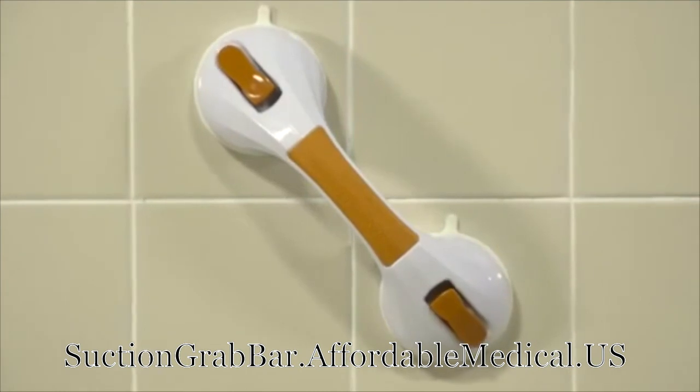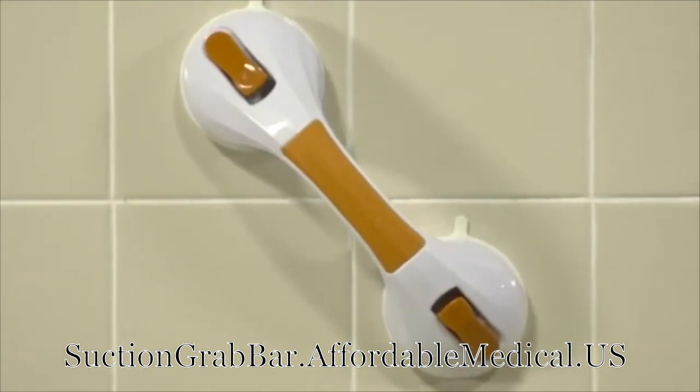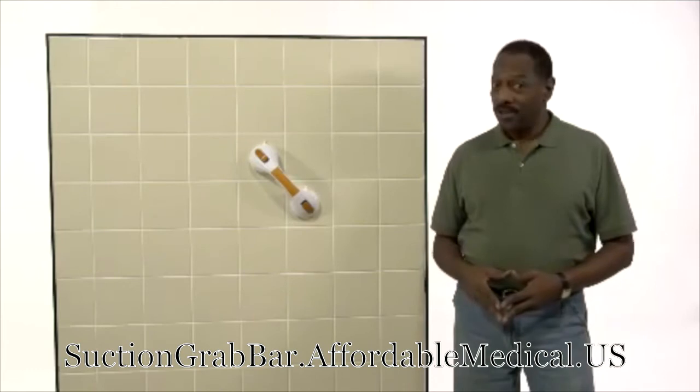The Drive Medical Suction Cup Grab Bar is safe, secure, and easy to install. Get it today and help make your home safer.